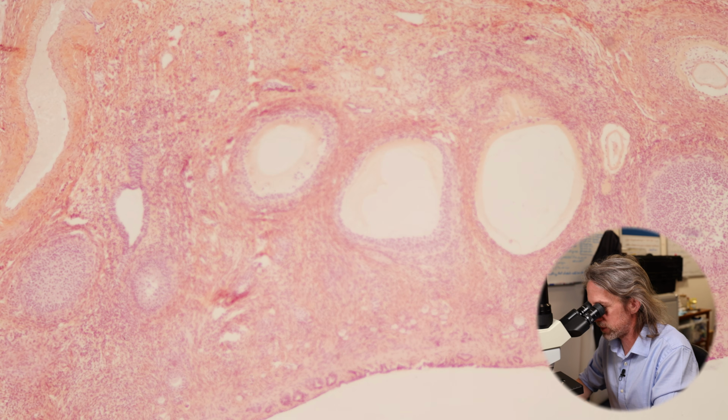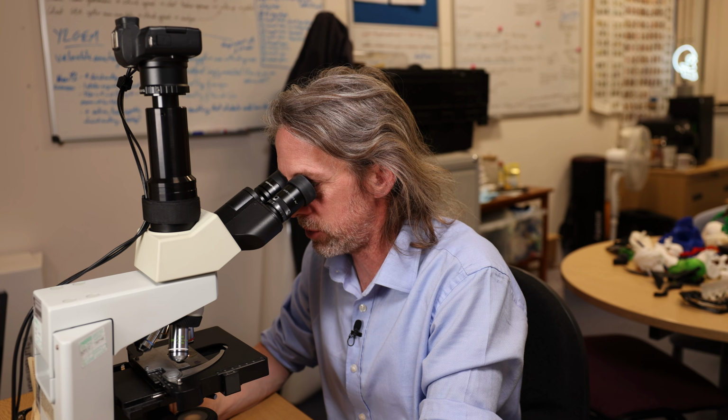And then you can see, as you move away from the edge, those developmental stages of the primary follicle developing and getting more follicular cells and more layers, and the oocyte itself is getting bigger, and then you get those thecal layers forming, and then it becomes the secondary follicle as it starts to pull in fluid, and as it pulls in fluid it makes a space around the oocyte, and the oocyte remains attached by the cumulus oophorus, and that oocyte is progressing into the second phase of second meiosis, and now you've got the Graafian follicle, and then one of those will be picked and the oocyte released during ovulation.